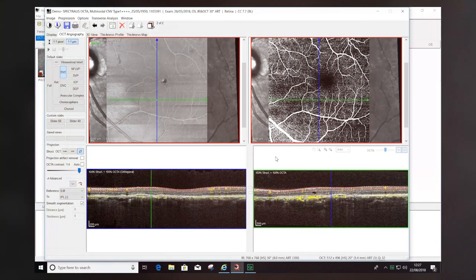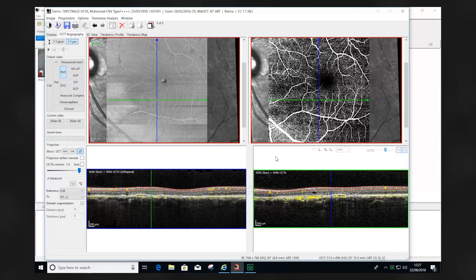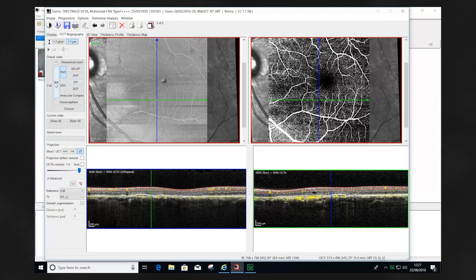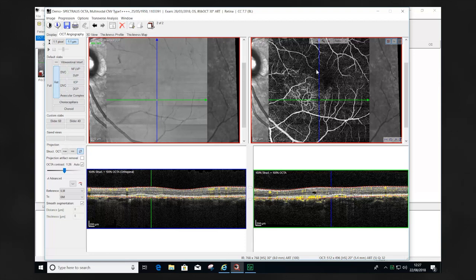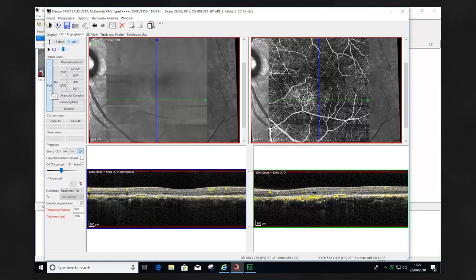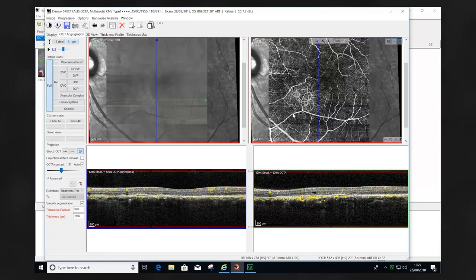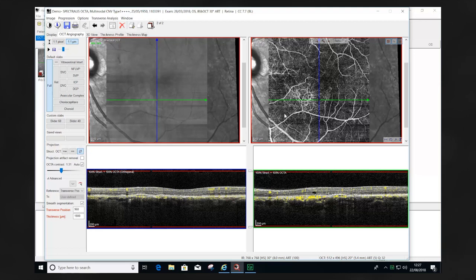When viewing OCTA scans for the first time, it's important to remember that the superficial vascular complex position only provides limited information. Using the retina and the full retinal segmentation provides information at deeper locations as well as more superficial locations and therefore we will be able to identify the presence of choroidal neovascularization or neovascularization elsewhere more easily within the OCTA scan.